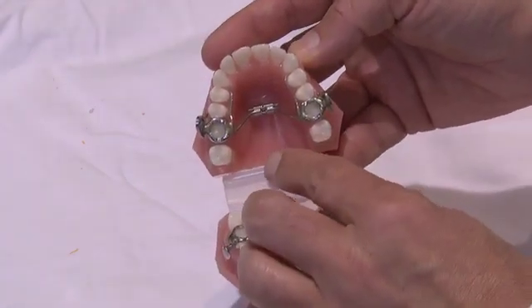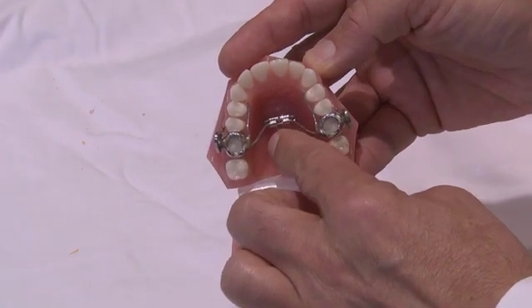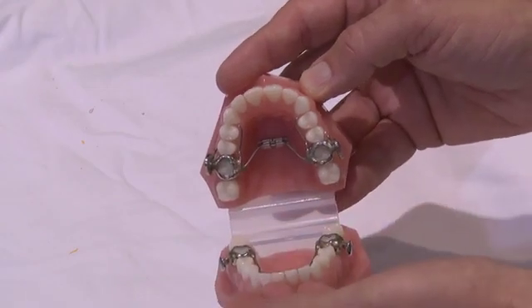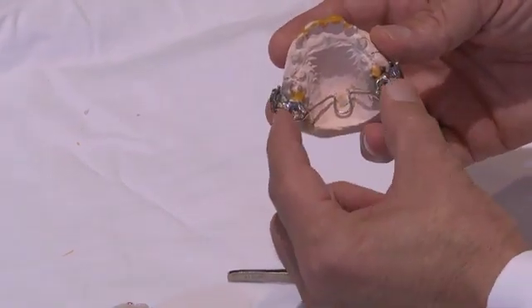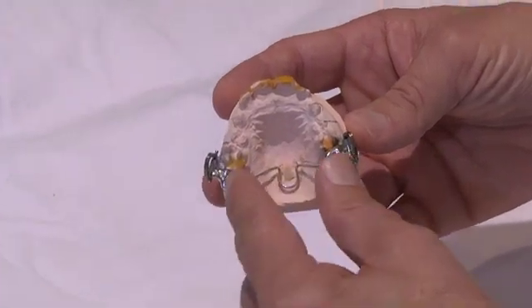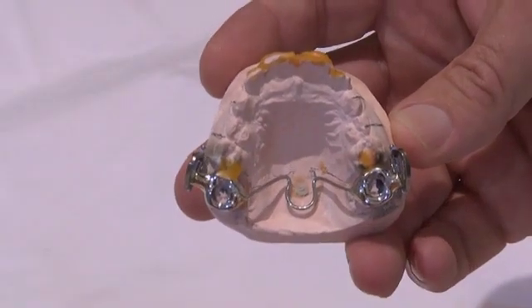In this MARA design, we have an expander so that we have the ability to widen the upper arch in preparation for translating the mandible. In the design I'm actually going to fit in the mouth today, we do not need arch development, and therefore we have a standard transpalatal arch. The reason we want a transpalatal arch is it limits the headgear effect of the MARA.